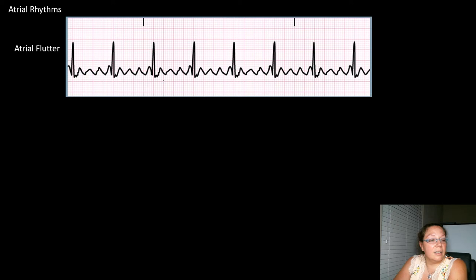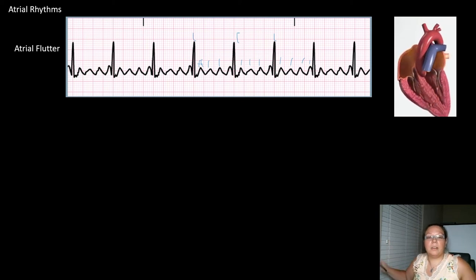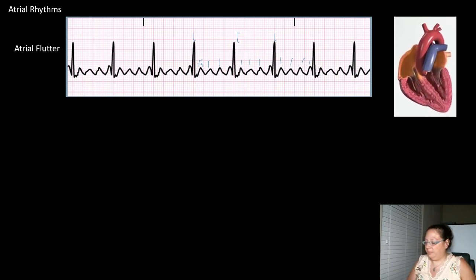But this sawtooth here means that your atria are firing at each one of these. These are each little firings. So your atria are pumping at each one of these, and your ventricles are pumping at each one of these. So these are atria, atria. So what's going on is atria, atria, atria, atria, ventricle, atria, atria, atria, atria. So it's almost like your atria and your ventricles are disconnected. What does that look like on our heart? Just like that. Your atria are going like this at their rate, and your ventricles are pumping where they're supposed to be. They're having a dance party.